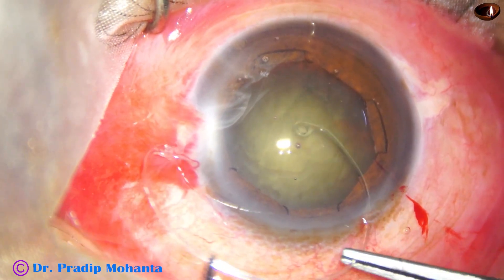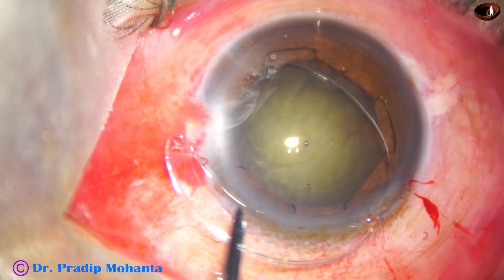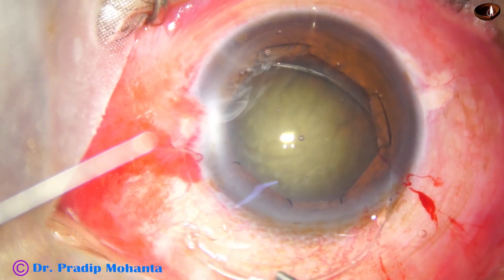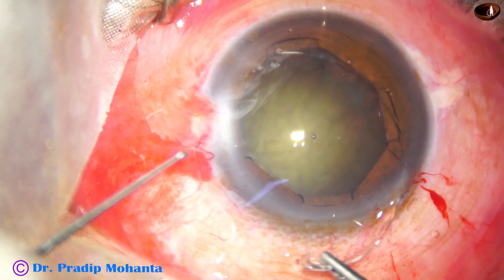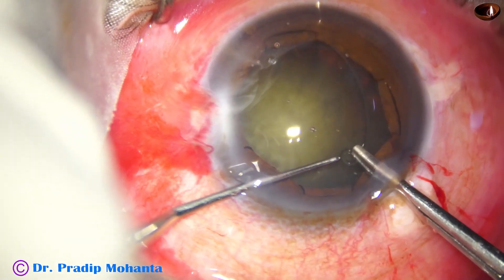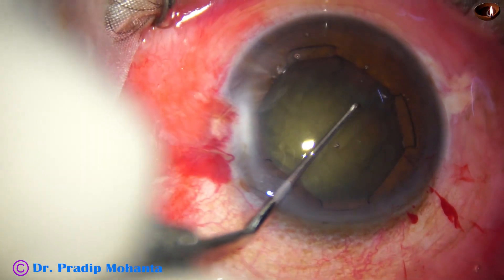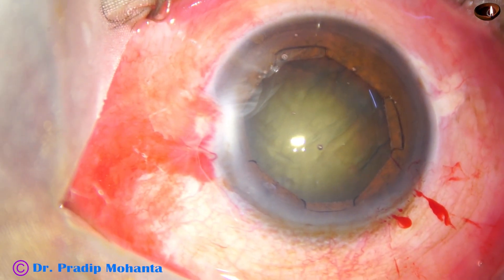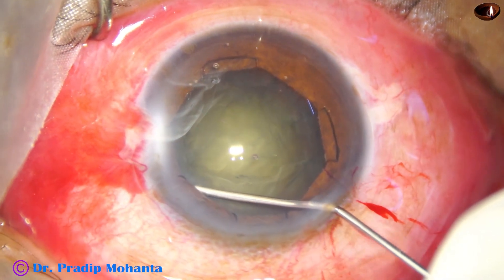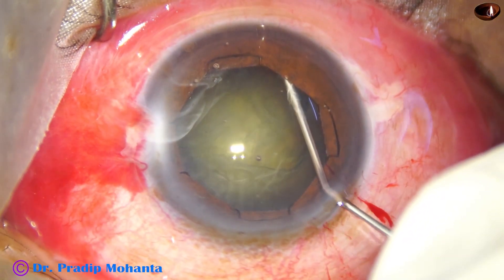Here goes the capsular tension ring — the leading end goes under the anterior capsular ring. Now gently push it, and the Sinskey hook goes through the side port, ready to tuck the trailing end under the anterior capsular ring. And here it goes. The bag is now supported and stabilized to some extent so it will not easily come out.